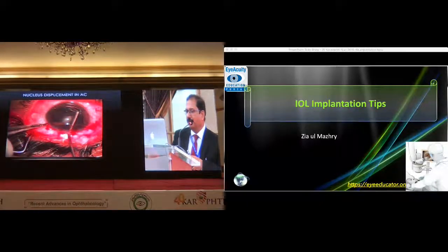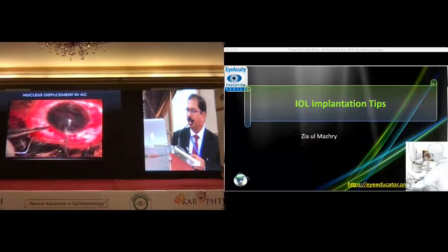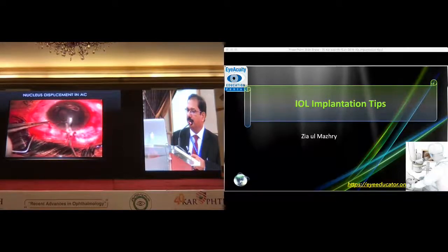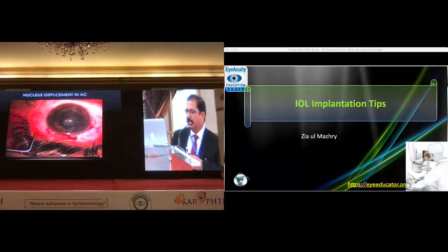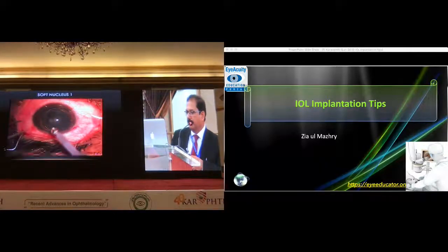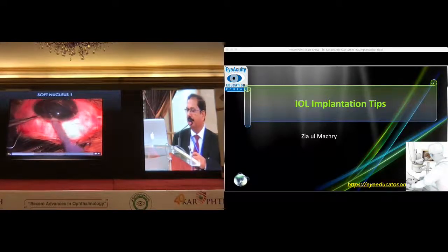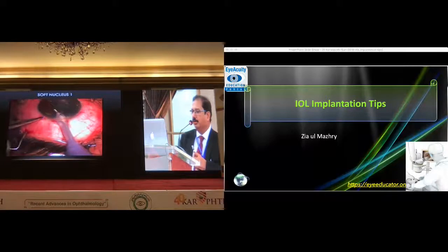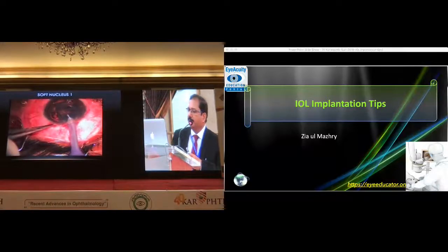The first thing is, if you have to manage it, you have to push the nucleus into the anterior chamber — just bring it into the anterior chamber. Displace all the nucleus, and after doing a hydro dissection, just rotate it and it will come into the anterior chamber. This is the first step. Then some viscoelastic is pushed in front and behind the nucleus, primarily to protect the endothelium and posterior capsule. It is taken into the anterior chamber in just a few seconds.